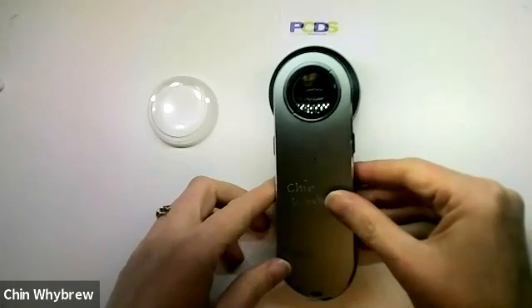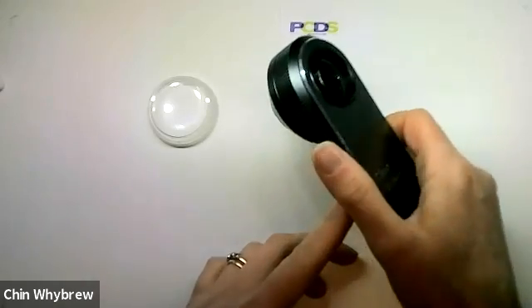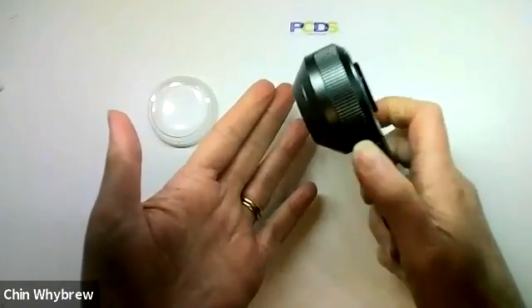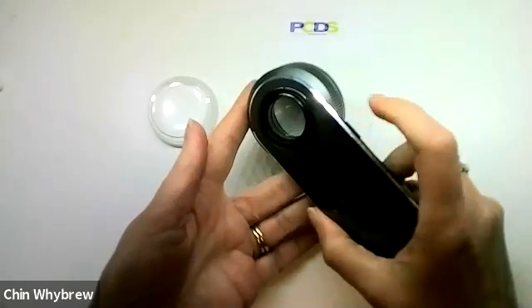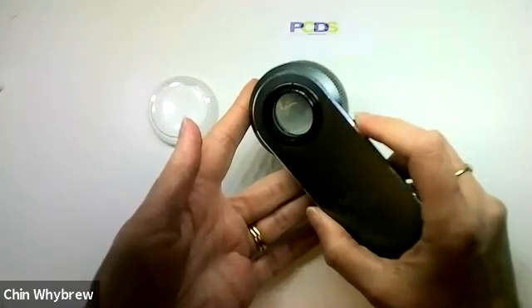This is the DermLight DL3 — it's a nice dermatoscope. It has a button on this side which turns it on, and then the button on the other side switches it between modes: between polarised and non-polarised modes.